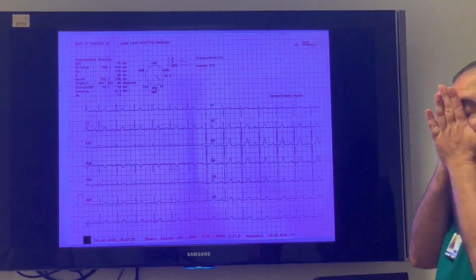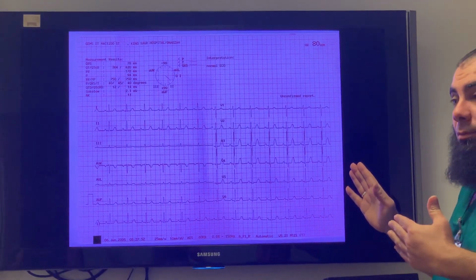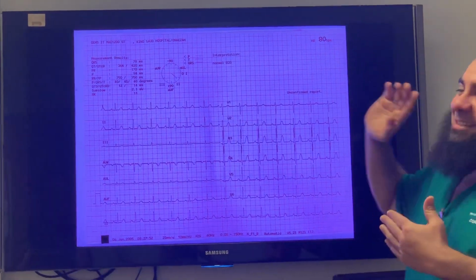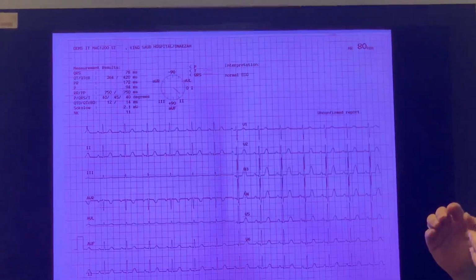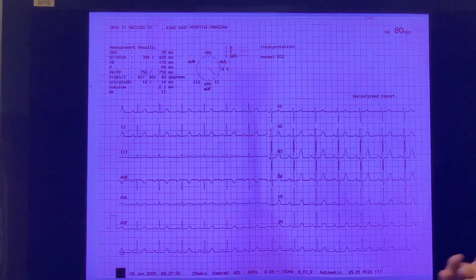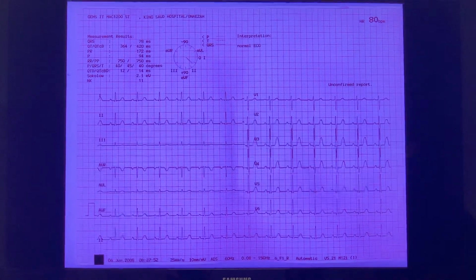Okay. For whom is that ECG? Do you know? For the king. It is a hospital I was looking at before, but it was a machine. Just the machine. It is actually the default of the machine. I didn't attach it to any patient. I just told the machine, give me your standard, and it printed that off.